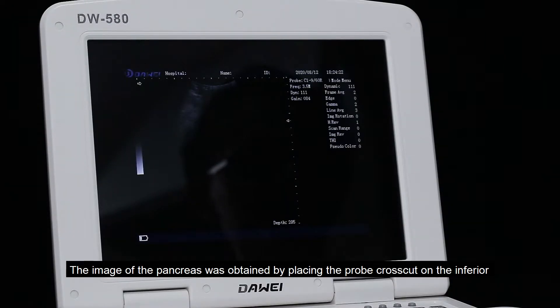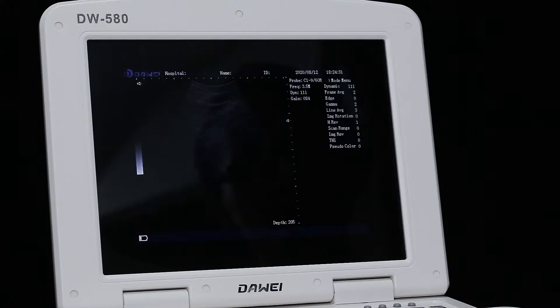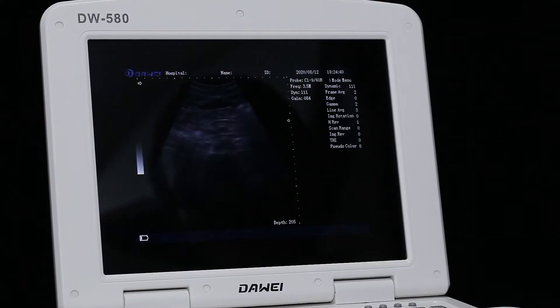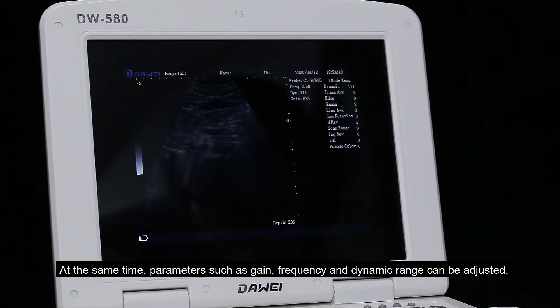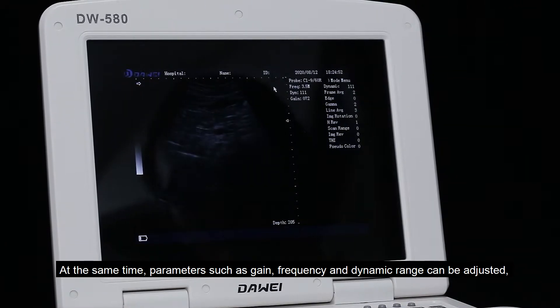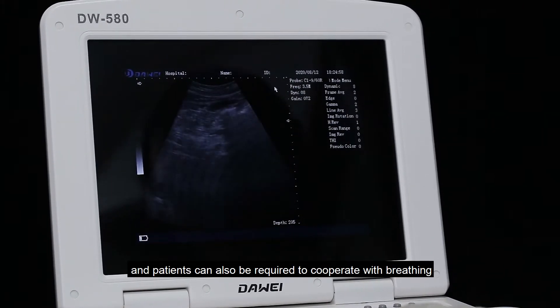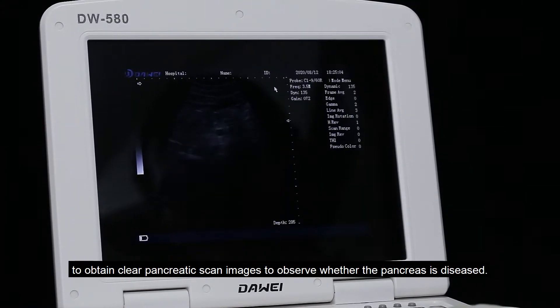The image of the pancreas was obtained by placing the probe crosswise on the inferior section of the xiphoid process. Pay attention to the direction of the probe, then swing the probe up and down. At the same time, parameters such as gain, frequency, and dynamic range can be adjusted. Patients can also be required to cooperate with breathing to obtain a clear pancreatic image and observe whether the pancreas is diseased.